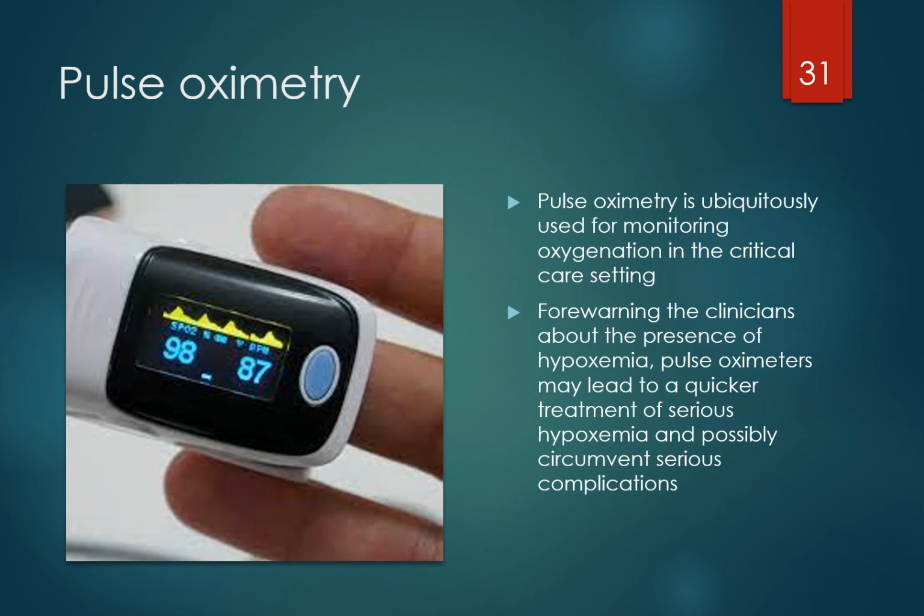Another good way of measuring the oxygen content of a patient in a hospital setting is the use of pulse oximetry. Pulse oximetry is used throughout every ICU, it's used in every step down, it's used everywhere. Even at the bedside, the floor bedside, people use it. And people have these at home. This is a great way of monitoring your oxygen saturation as well as your heart rate. It's a simple device that goes on your finger, and basically it could tell you the percentage of hemoglobin bound in your arterial blood. But actually it's peripheral blood, so it's a peripheral system of measuring your oxygen level. And remember, as someone is sick, if someone has a pneumonia, their SATs will go down. And if someone has any kind of hypoventilation because of, say, sedation or anesthesia, their SATs will go down. So it's a great tool to use.